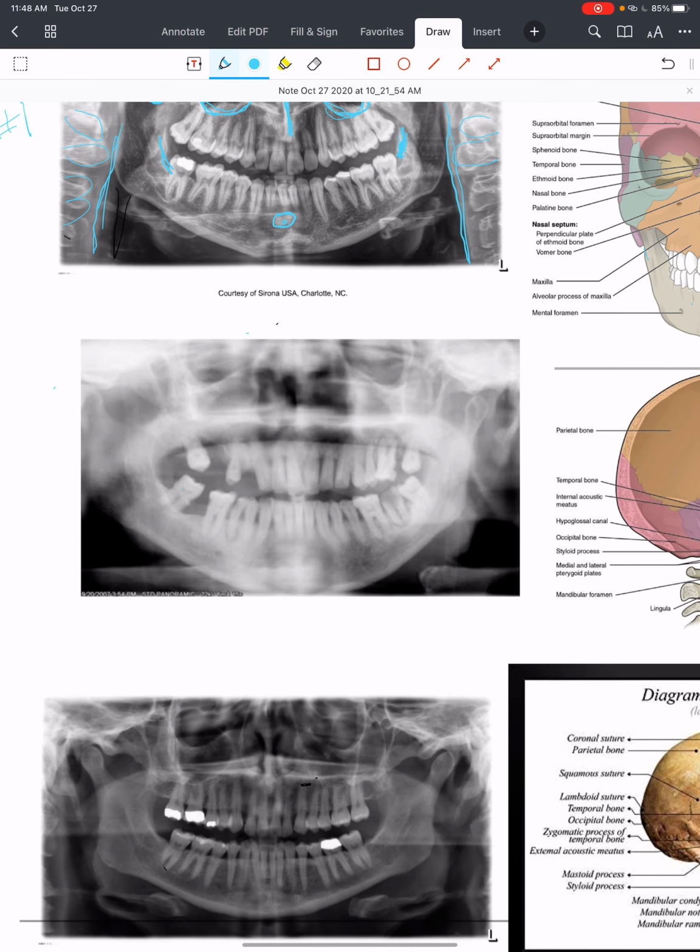Now I'm going to come down here to image number 2. And I know right off the bat you're thinking, wow, this is a terrible image. And that's exactly why I picked it. So I picked this image because I was easily able to identify the errors.